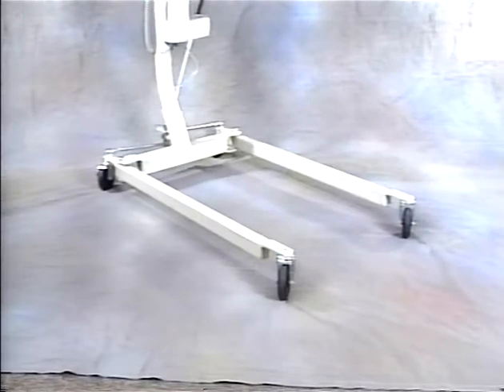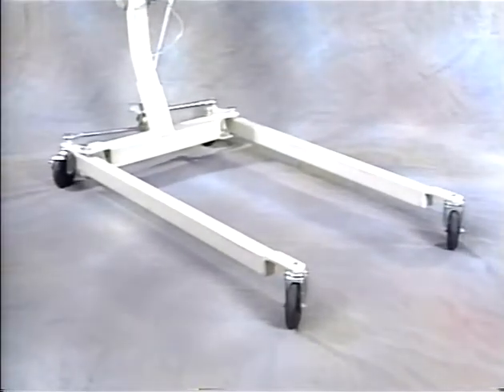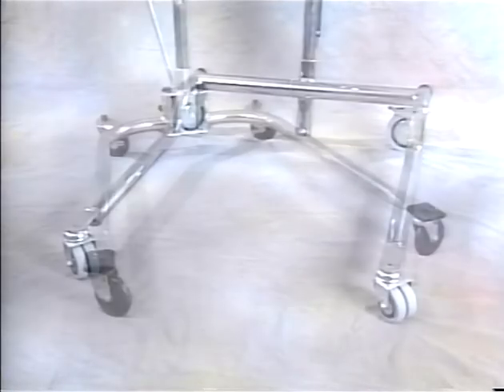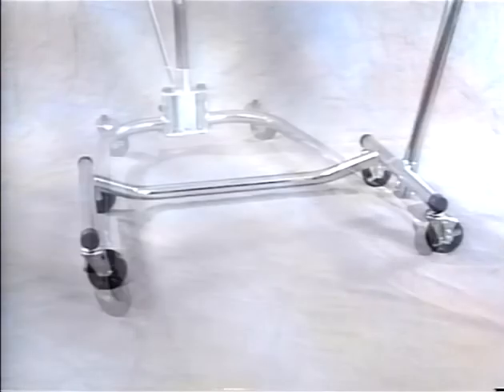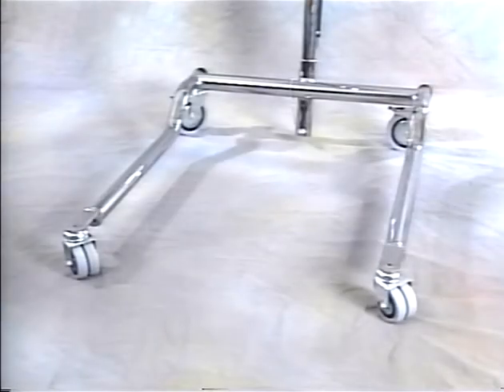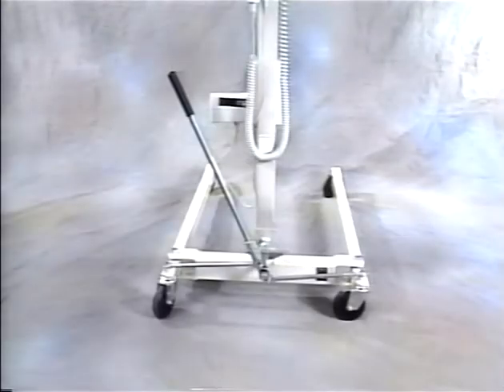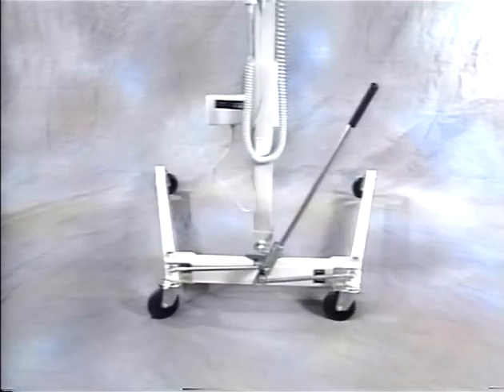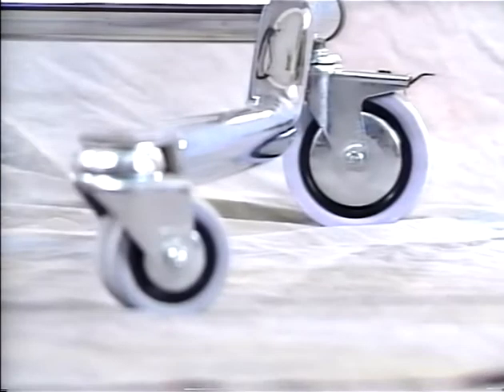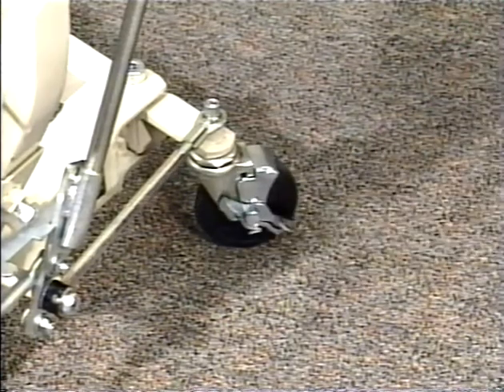Let's begin at the bottom with the base. The base includes the frame and casters. There are two types of bases, fixed and adjustable. C-base lifts have fixed position legs. U-base models can have fixed position or adjustable legs. The adjusting lever handle controls the spread width of adjustable legs. Casters allow for easy movement during transfers and lock the unit in place when it is not being used.